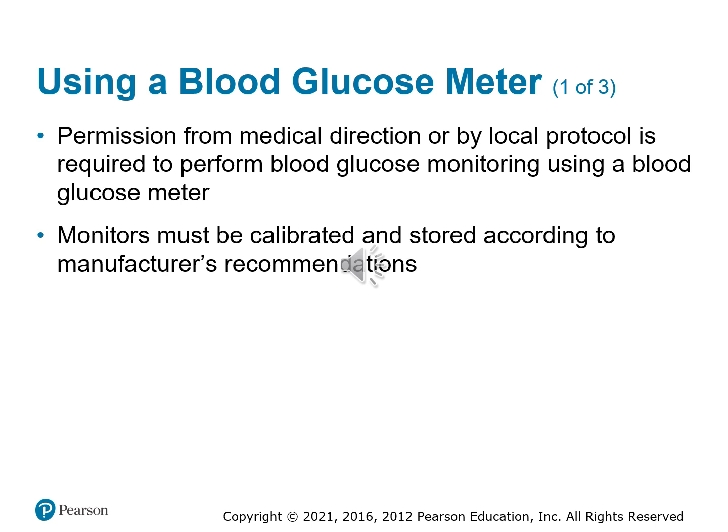Commonly patients will have their own blood glucose meters, especially if they're diabetic. If they said they just checked their blood sugar, you can use their number. Best practice is to always perform it with your own equipment. If nothing else, it'll verify that their number was accurate, and it gives you that true good baseline moving forward.